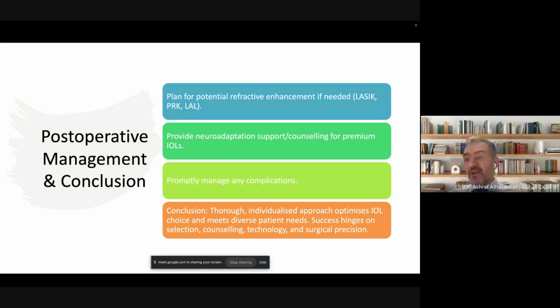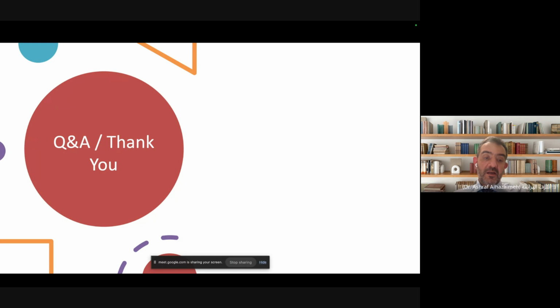Make every effort to understand what is going on with this patient. Is it related to dry eye? Is it related to the centration of the IOL, a tilt, or a misalignment of the lens, before going to the YAG laser? Because this could be due to other causes. And if you do YAG laser in these patients, it would be difficult to remove and exchange your lens.